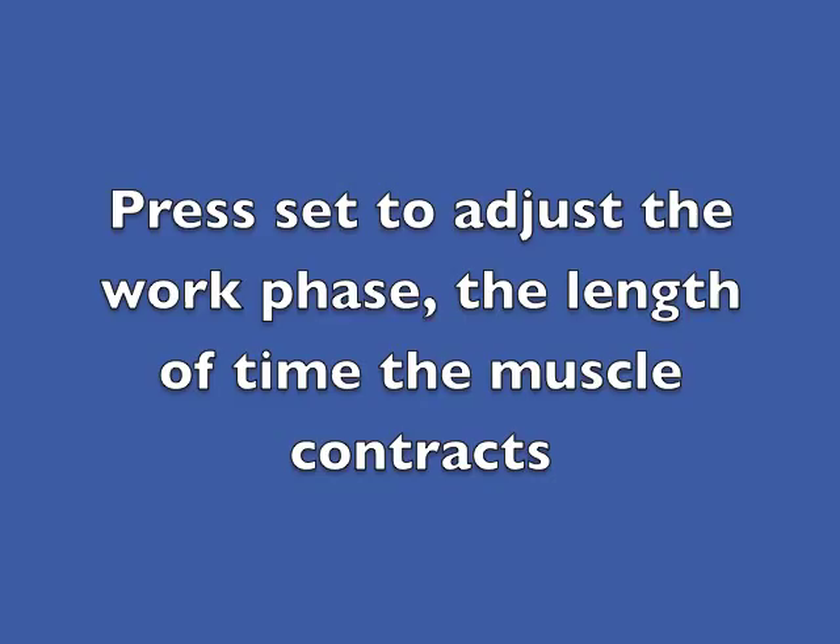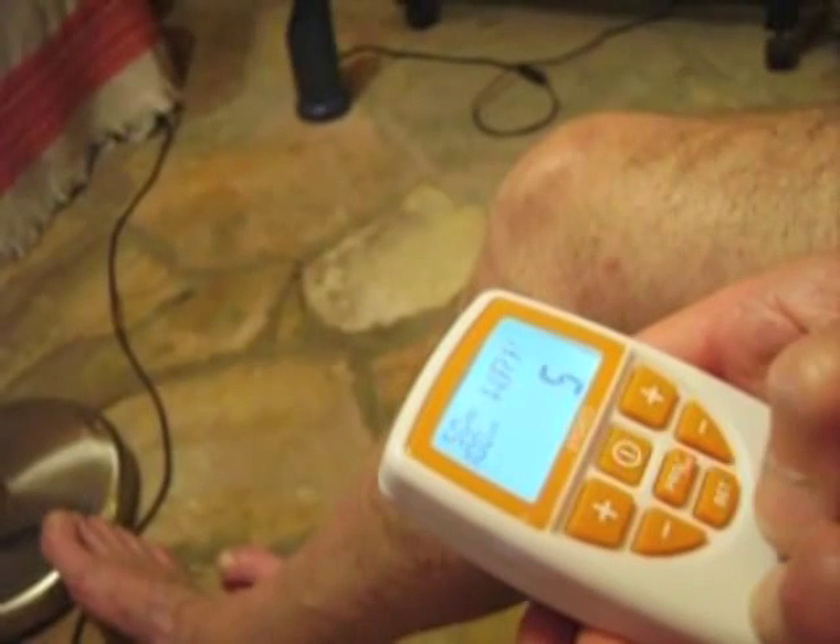Press set again and the next parameter is the work time — the amount of time that the muscle will contract. This should be set to four seconds using the plus or minus keys on the right-hand side of the machine.